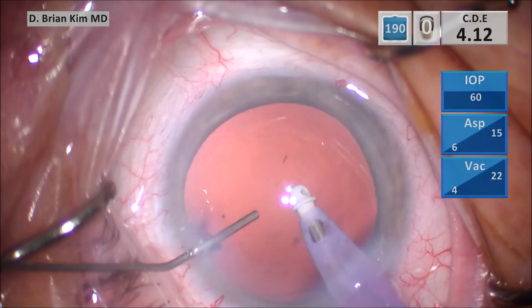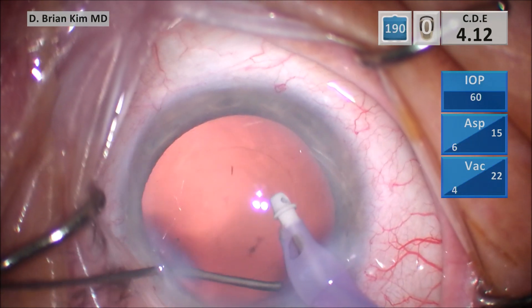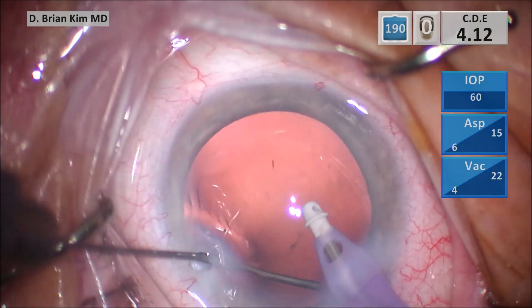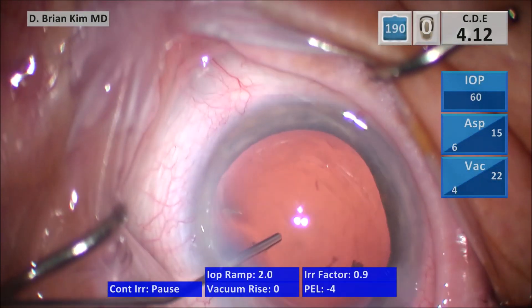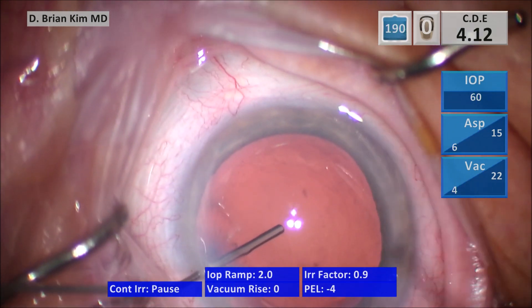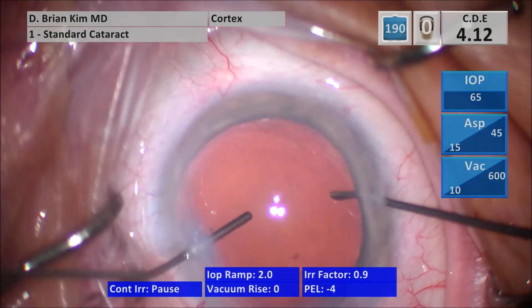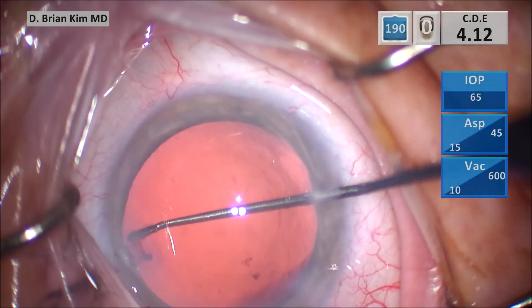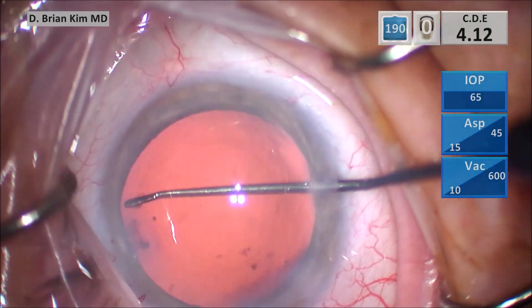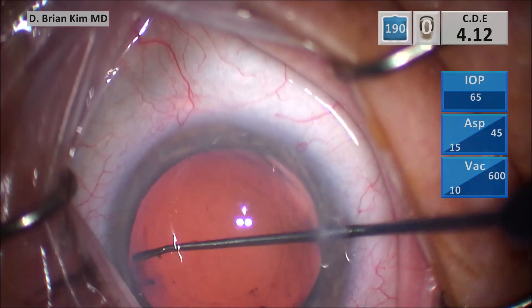I'm pushing BSS and I'm going to pulse the sub-incisional space using that burst of fluid — it can help liberate any material that's in the sub-incisional space. I inject some cohesive viscoelastic and then I start polishing again the anterior capsular rim to make sure I can remove as much lens epithelial cells as possible, polishing on the left side and then on the right side as well.